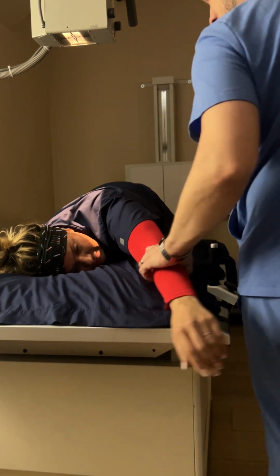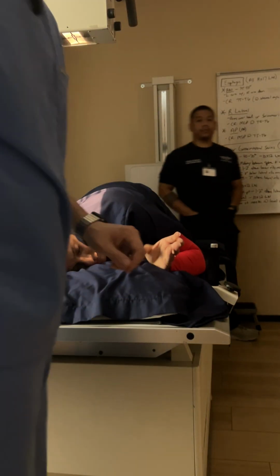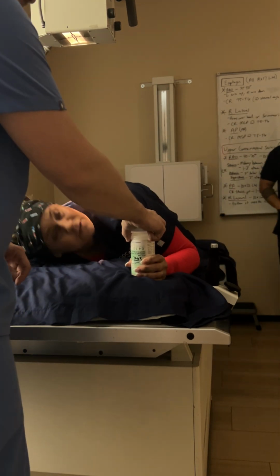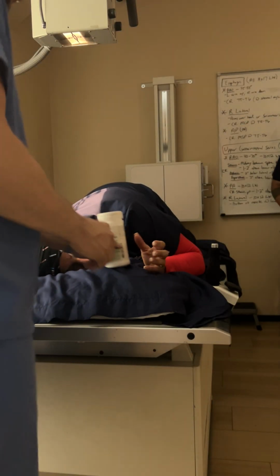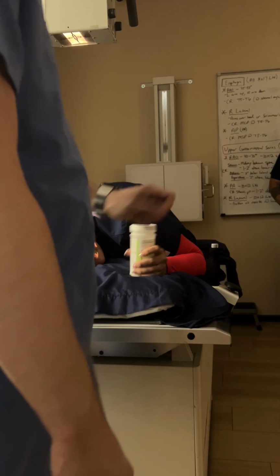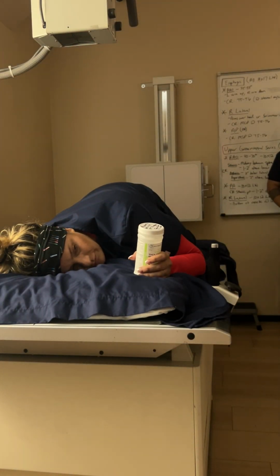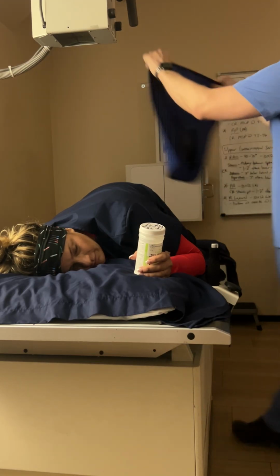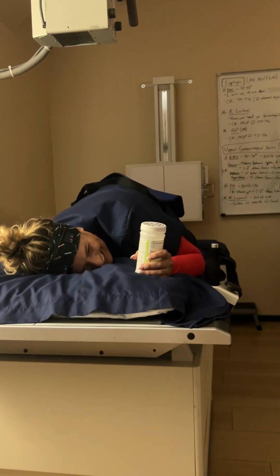Then they're going to bring this arm down, and you're going to give them the cup to hold. You can't stand here and hold it because you have to make the exposure. So you're going to give this to the patient. It's going to have a straw in it. Before you make your exposure, you're going to say, okay, start sipping, okay? Because you want to make the exposure while they're drinking the barium, so that their esophagus is full of barium, okay?